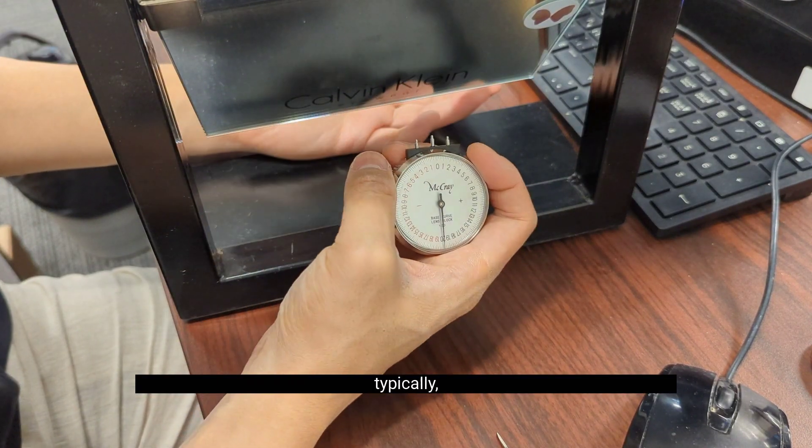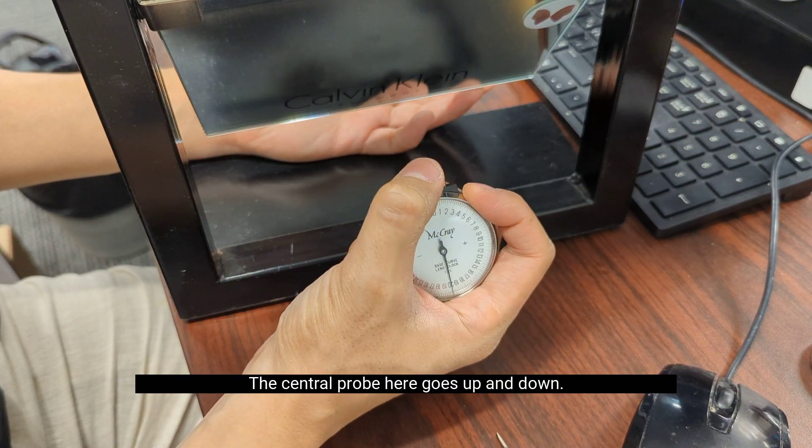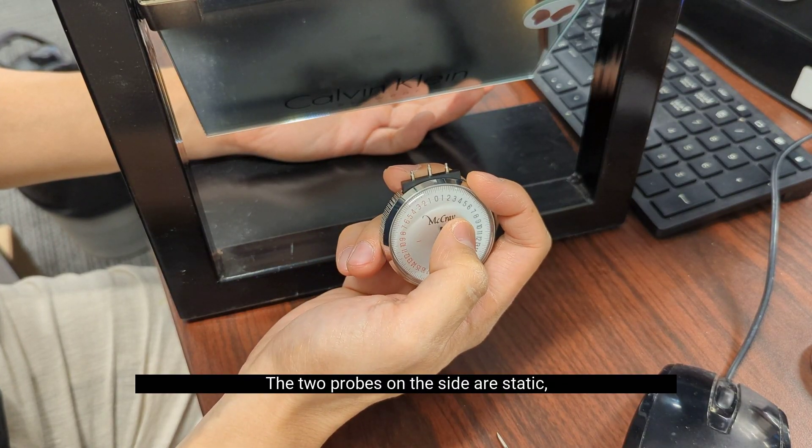Typically what you're going to see is a lens clock has three probes. The central probe goes up and down, and the two probes on the side are static.